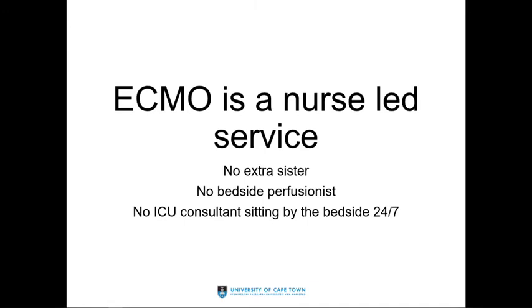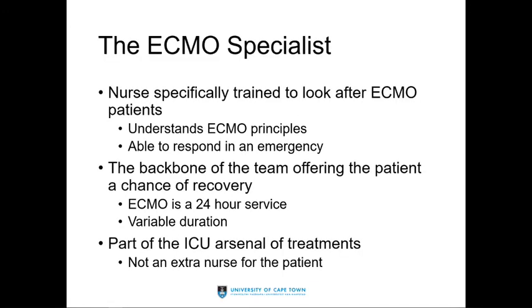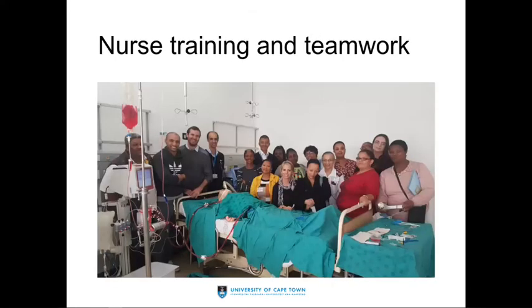So just so you understand, the nurses do their own training course, because something can happen at any hour of the day. So if you are looking after an ECMO patient, please just ask the nurses for some advice as well. They are well trained in looking after it and can give you some valuable insights. And then it's just part of our ICU arsenal of support therapies. It's not something extra or super ordinary.